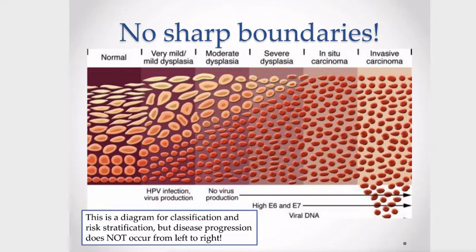So let's just talk a little bit about some of the distinctions. And first of all, let's jump to CIN3, because I think this is perhaps the easiest thing and certainly the most important thing to recognize for trainees who are trying to master and copy the skill of their mentors in becoming reproducible and attuned to the standards here. So with CIN3, we typically have a uniform cell population from top to bottom with really no evident maturation, very minimal or no maturation. We will see mitotic figures at or above the mid-level of the epithelial mucosa, and we will often see atypical mitotic figures.